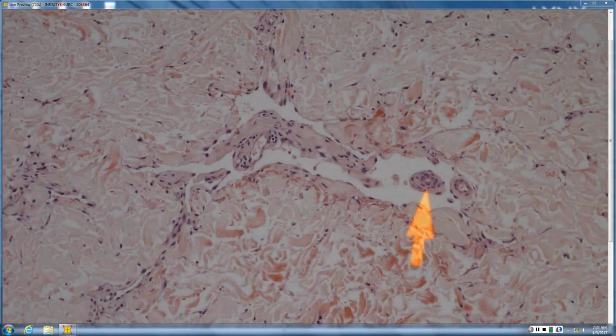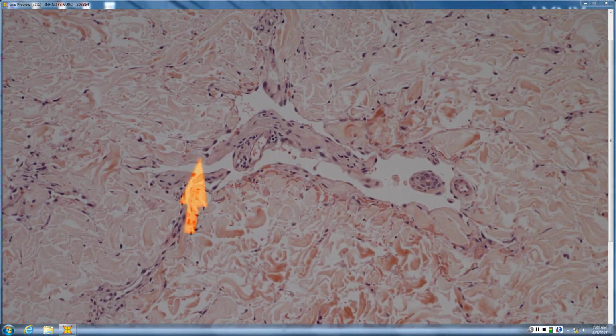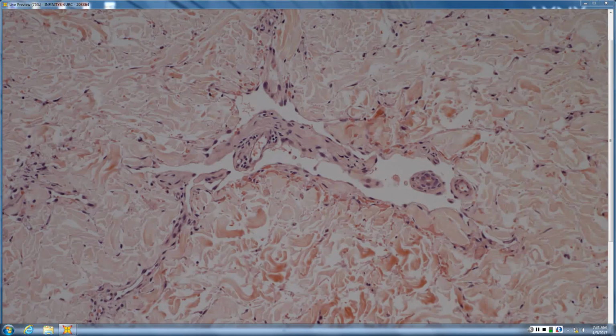So that's actually an eccrine duct. Okay. So why would you have an eccrine duct floating in the middle of a vessel? Maybe there's a pre-existing vessel and collagen, and that all kind of is jutting out into this. There's another little pre-existing vessel jutting out into that space. It's like you have a new vascular space wrapping around a pre-existing structure.